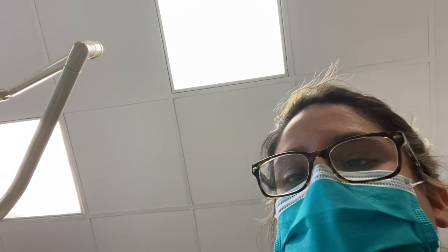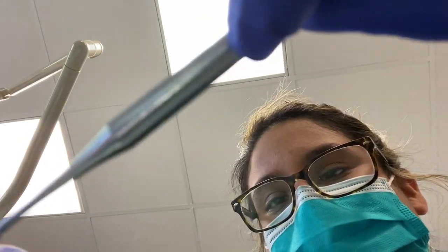So I'm just gonna have you tilt back for me. Beautiful. Right there. And I'm just gonna take a look. Just a little one. Perfect.